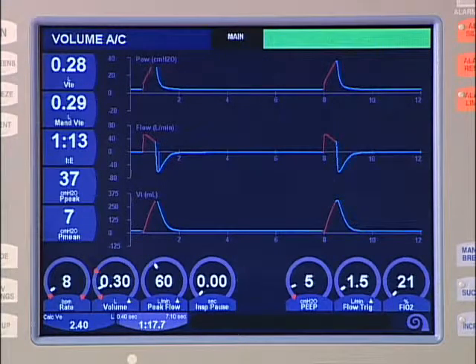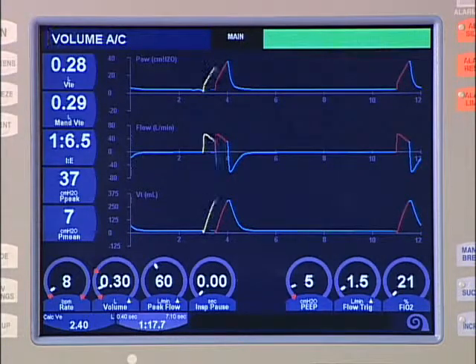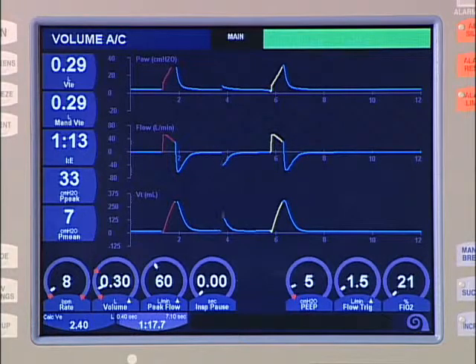Waveforms are color coded to correspond to different types of breaths and phases of ventilation. Red denotes the inspiratory phase of a mandatory breath. Yellow denotes the inspiratory portion of an assisted or spontaneous breath. A blue tracing represents the expiratory phase of a mandatory, assisted, or spontaneous breath.